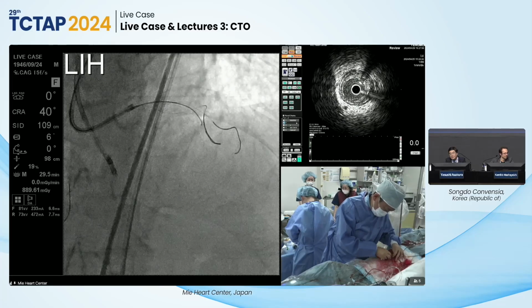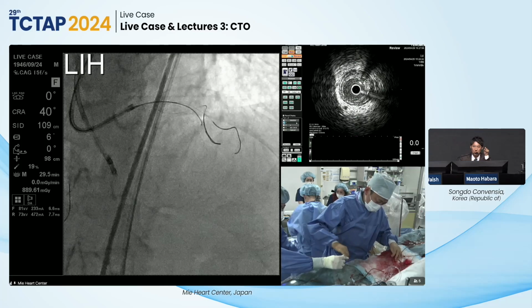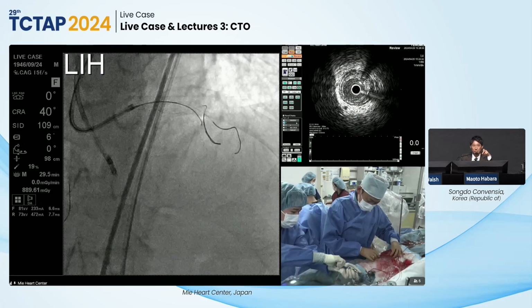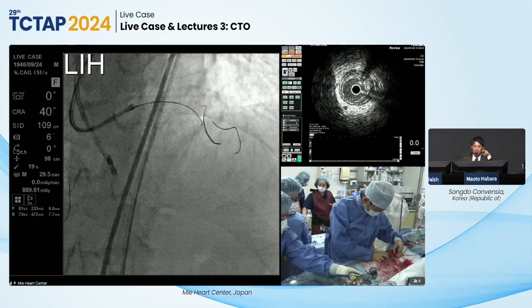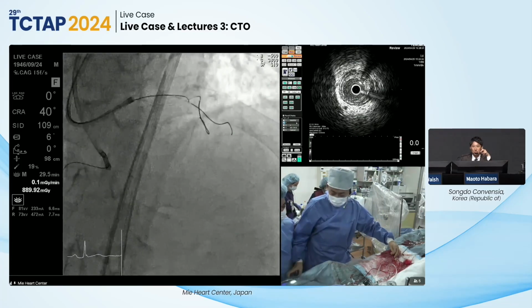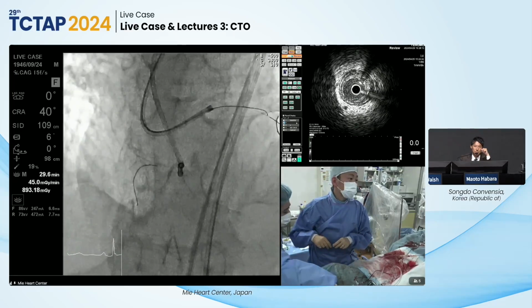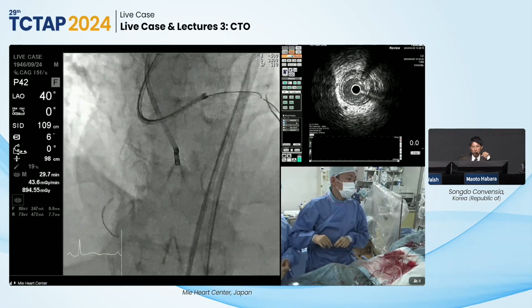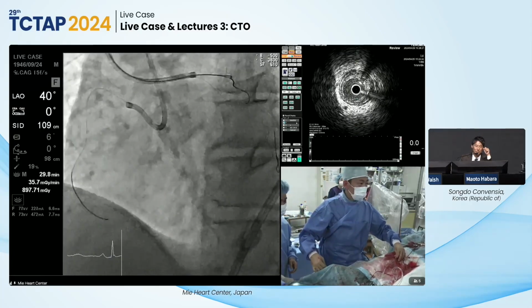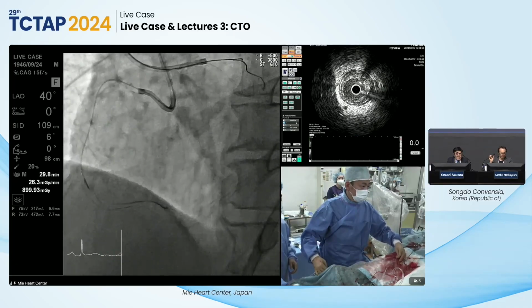So the difference between the Sasuke and the Crusade R double lumen catheter is the angle of the side port. Sometimes Sasuke is a little bit straighter compared to the Crusade R, so the angle of the side port on the Crusade R is a little bit larger. That's for the puncture. So maybe there is some advantage to puncture, but there is no evidence about that. There's no evidence for a lot of these things. I don't have Crusade available to me, so.